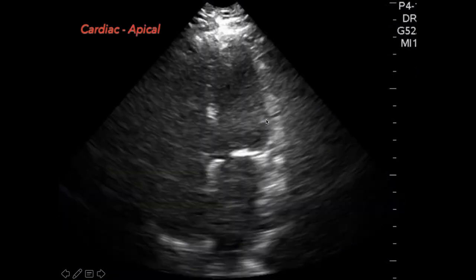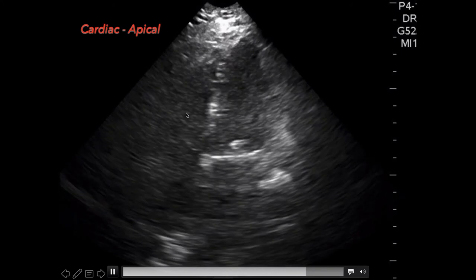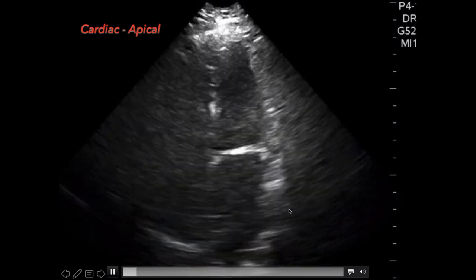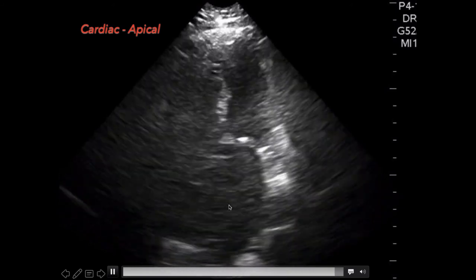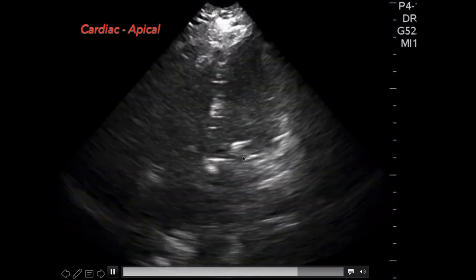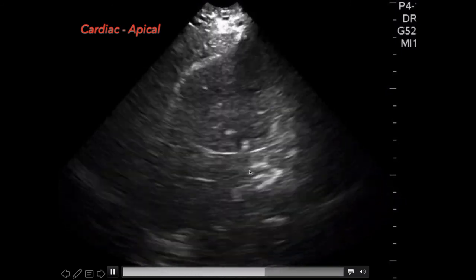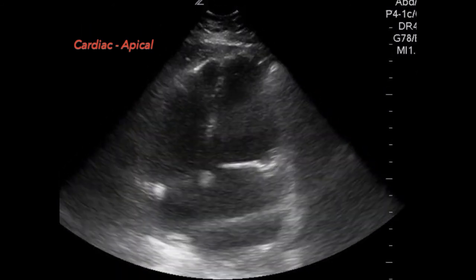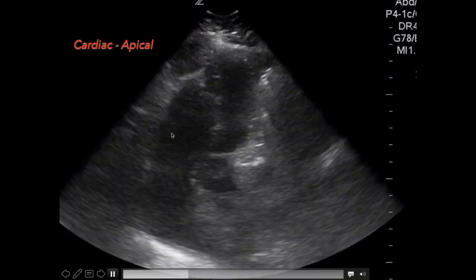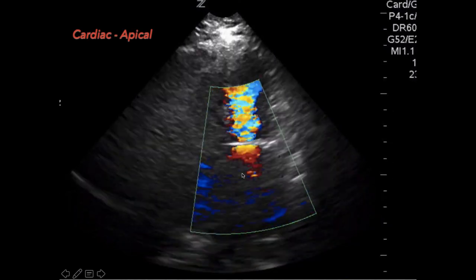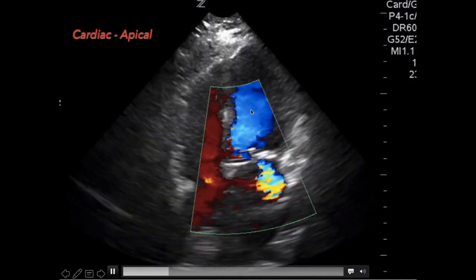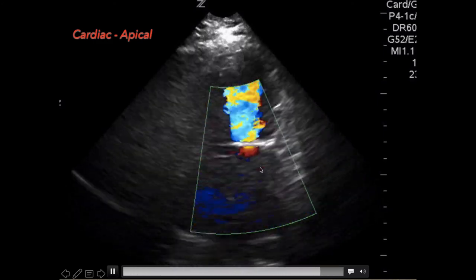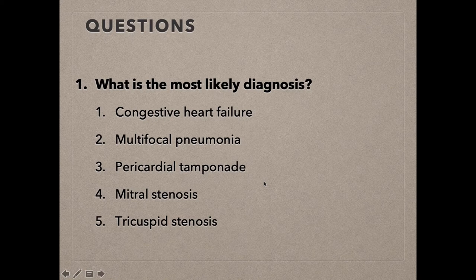The contractility of that muscle looks good. Apical four-chamber view shows left ventricle, right ventricle, left atrium, right atrium. What strikes me about this clip is that the left atrium is very similar in size to the left ventricle - that is not normal. And that mitral valve - how would you describe it over the phone? Another apical four-chamber view with color flow shows very turbulent flow going through the mitral valve, with some regurgitation visible as well.